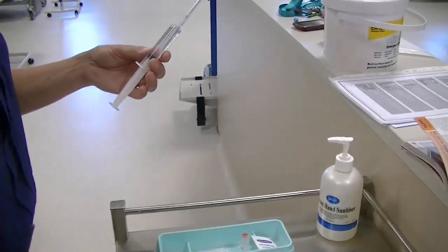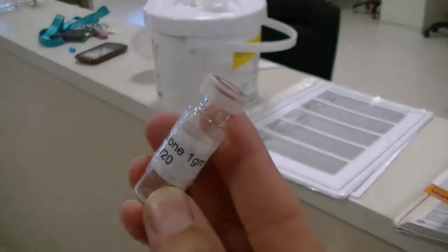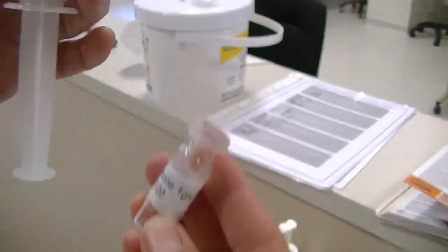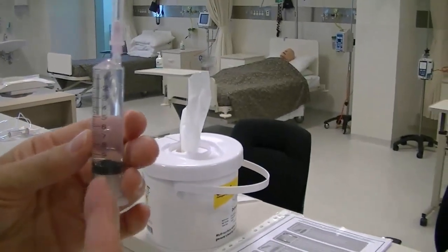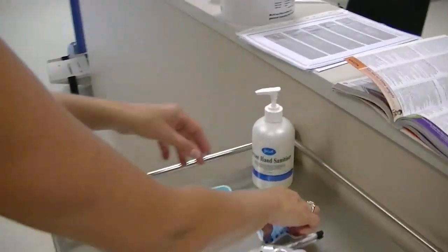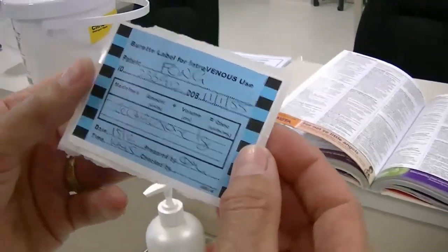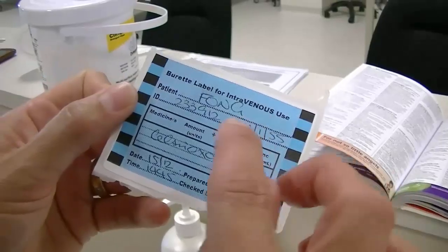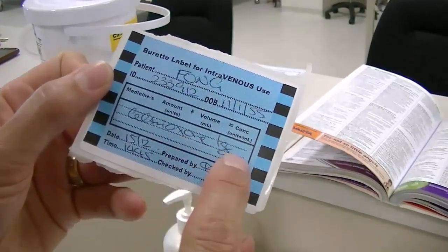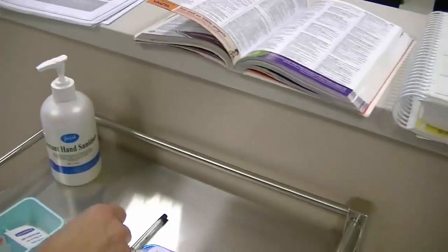Nurse, can you check this with me, please? Sure. So once again, I've got the ceftriaxone 1 gram, and I've completely drawn it up, and it's in 10 mils. There's bubbles, but it's going into a burette. Sure. Now I've also written up a label that will be put onto the burette to let people know that there is a drug in it. It's got a name, date of birth, ceftriaxone 1 gram, the date I've prepared it, I've signed it. Could you please sign it? Sure.